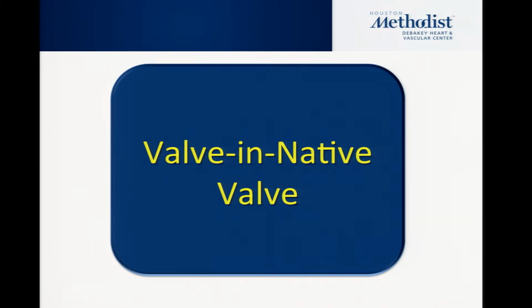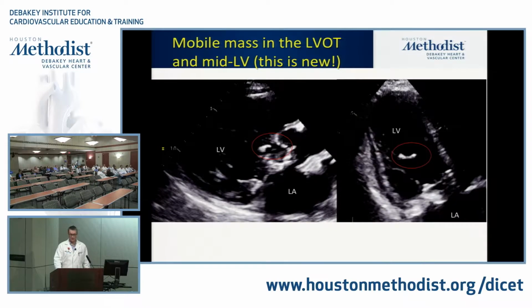Interesting, the echo texture is quite different. Did you have that before? The calcification? Yeah, they were there on the preceding ones, but obviously they weren't mobile because they were rigid, they were attached to each other. So it's the mobility that catches your eye, and that's because they ruptured bits. So I think it was a strut cord to the mid-anterior leaflet that just broke on both sides. So you're seeing both halves of it moving within the transthoracic.